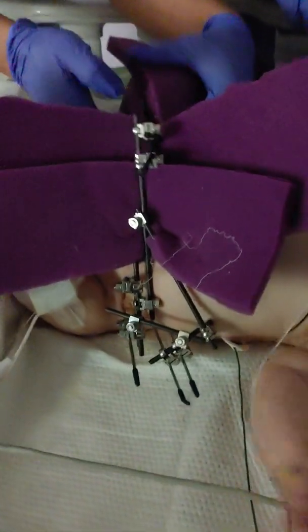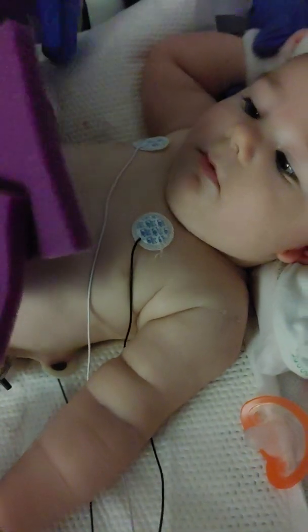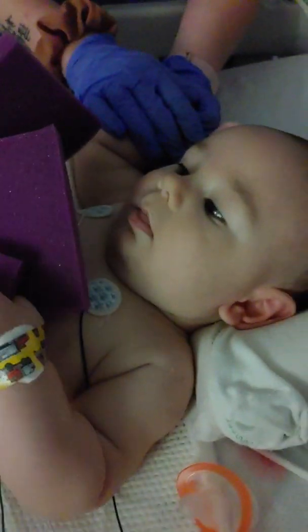Just so you can rewrap this as you need to once you're doing stuff. So it's just to keep the foam over here, right? Uh-huh. I think when you do pin care, just let it open, and then just keep protecting. Wrap it as much as you have to. So we can just leave it open now so we can clean stuff. That's cool. That's gonna be the way to do that.